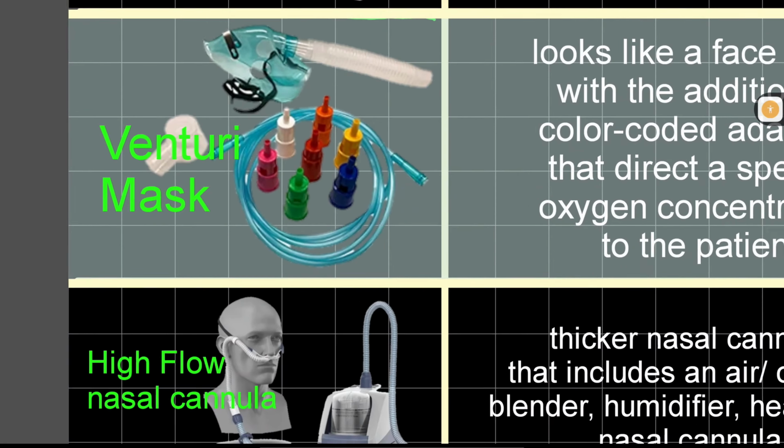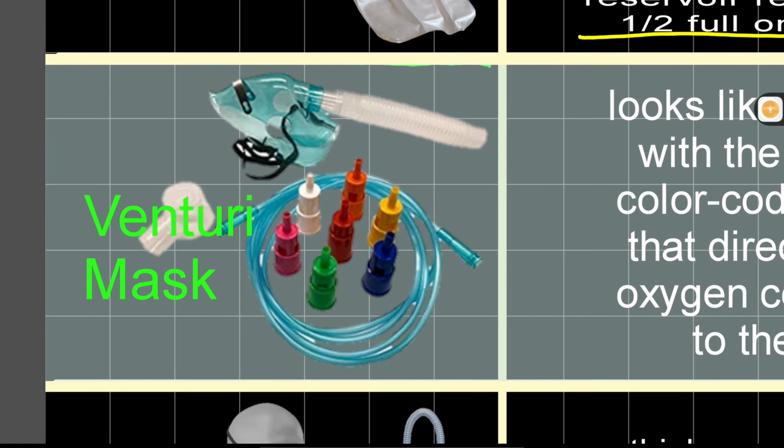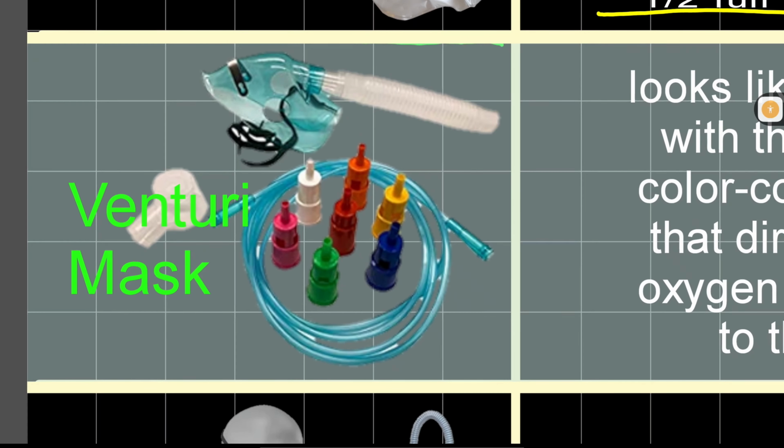Alright? So, next we're gonna move to your Venturi masks. If you haven't seen a Venturi mask, this is how it looks like. It has these masks here, and it normally goes with ports or valves.